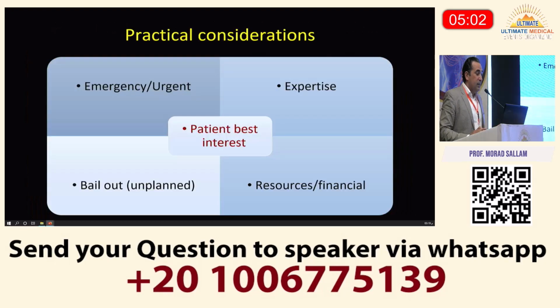Having said that, there are many practical considerations. We are professionals here, with different levels of experience and seniority. And you can see here: what are you going to do in an emergency? What are you going to do in an unplanned bailout? What are you going to do if you have lots of expertise and you want to push the limit with what you have? And finally, you are sometimes restricted by financial constraints and resources. So you will have to consider going outside the IFU. Just keep the patient's best interest in the middle and start to think about that.